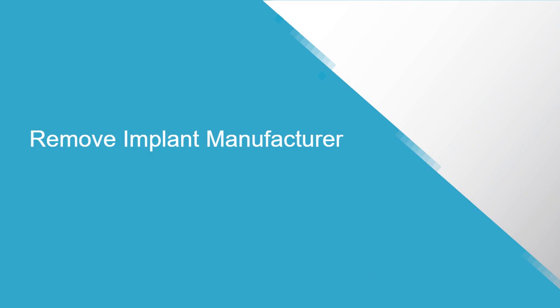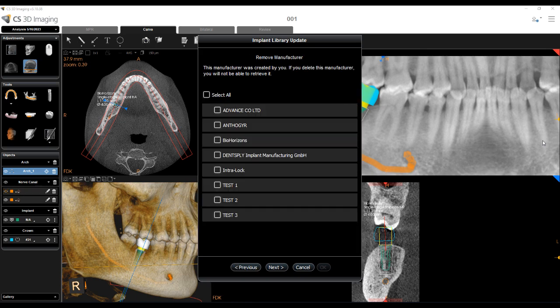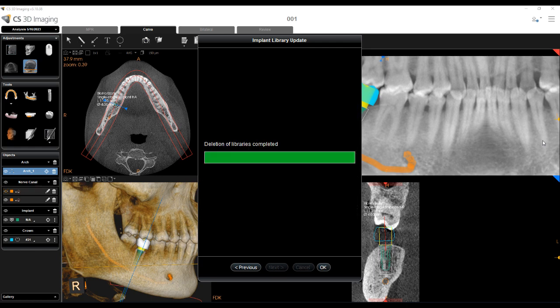Remove Implant Manufacturer: Select Remove Implant Manufacturer and click Next. A list of the installed implant libraries is displayed. Select the manufacturers you want to remove from the computer and click Next. When the action is complete, click OK to finish, or Previous to return to the options menu.